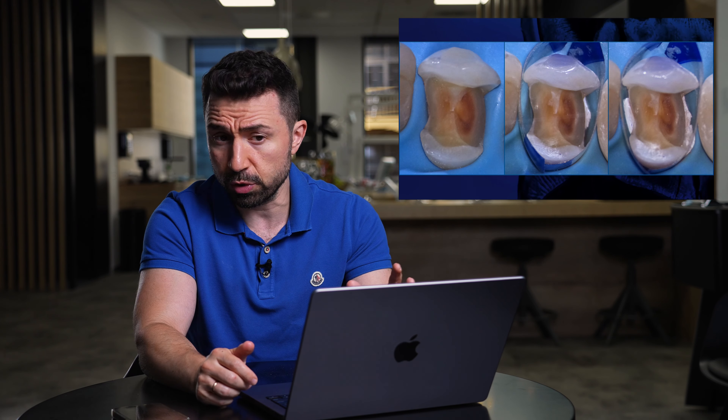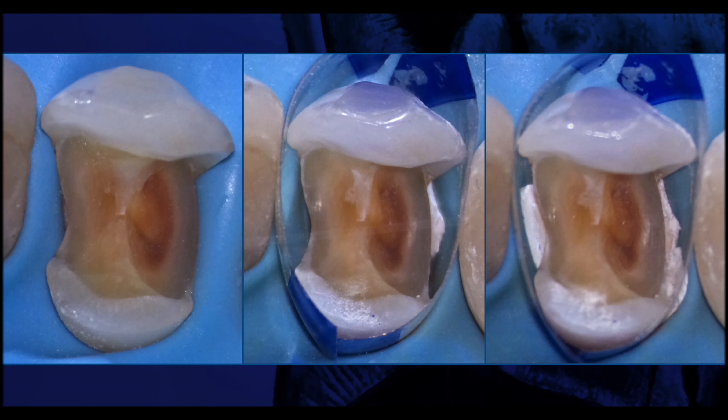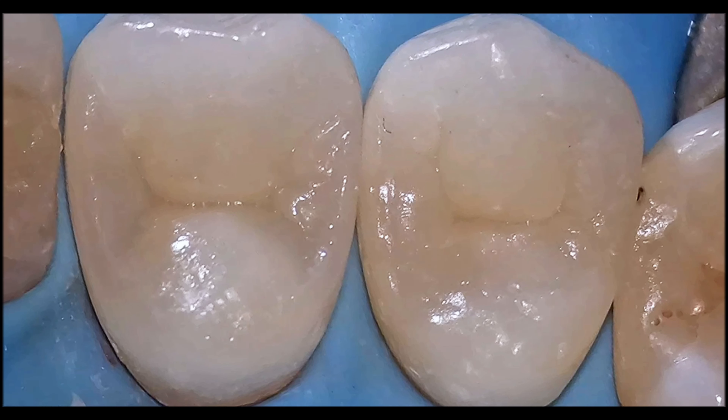Here you can see the initial situation. The second slide shows the gap between the matrix and the tooth in the V-shape area. Afterwards, after packing with Teflon, everything is sealed and nicely adapted to the surface.